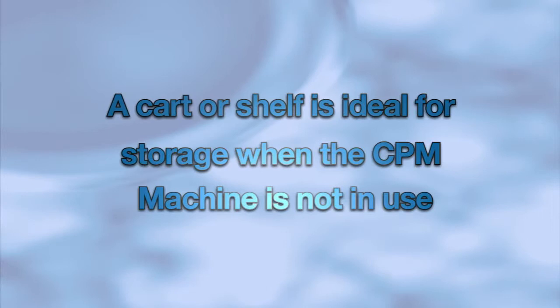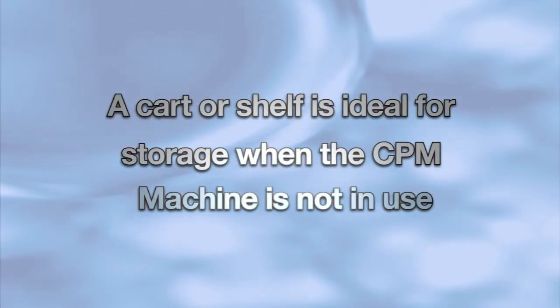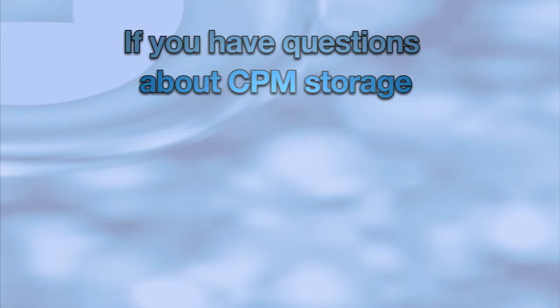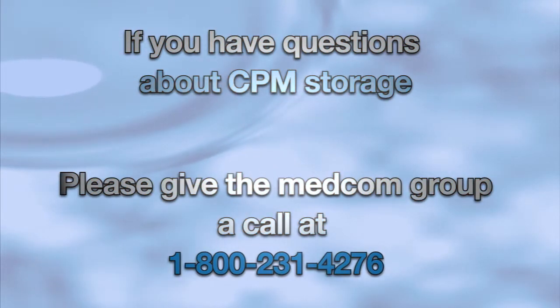A cart or a shelf is an ideal place for the CPM storage while the patient is not using the CPM machine. Some hospitals even use hooks on the wall or own specialty designed CPM carts that make storing their units easier. If you have questions about CPM storage, please give the Medcom Group a call and we'll work with you to find a solution.